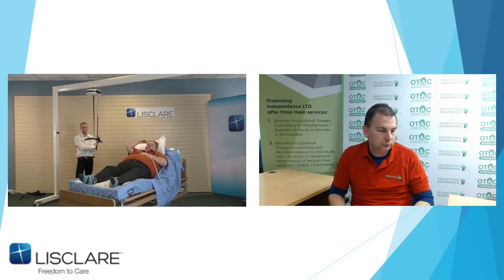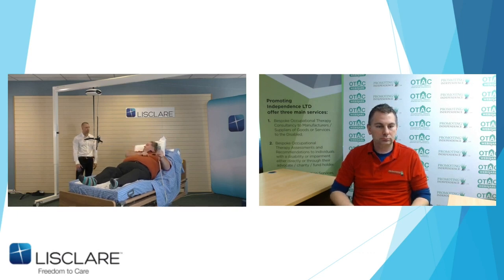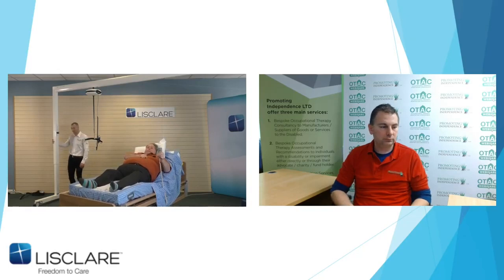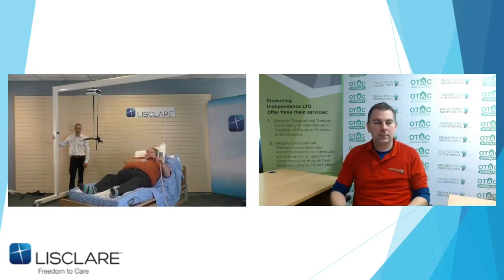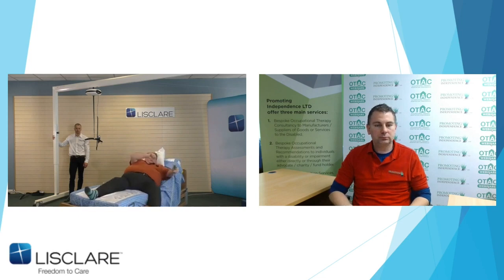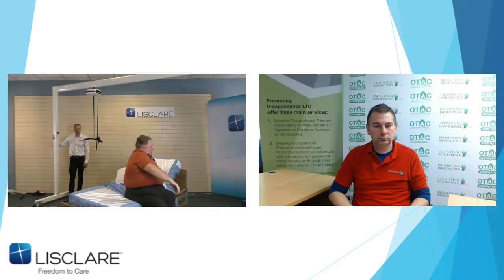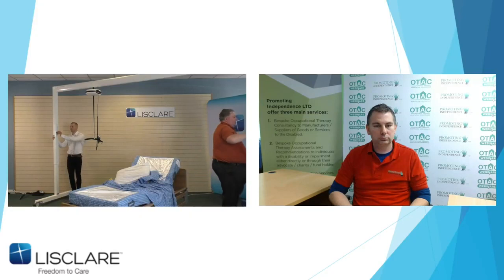But this gantry will actually lower down in sections, which I can show you now with John. Let me pop up. Sorry about that. I'll show you what I mean, John, if you go to the far side. It's actually got what looks like a hydraulic pump inside this, so that's why John and I lifted this with ease.